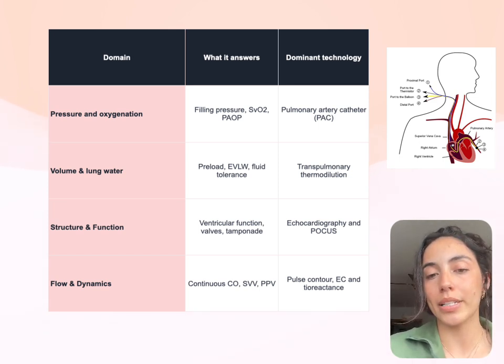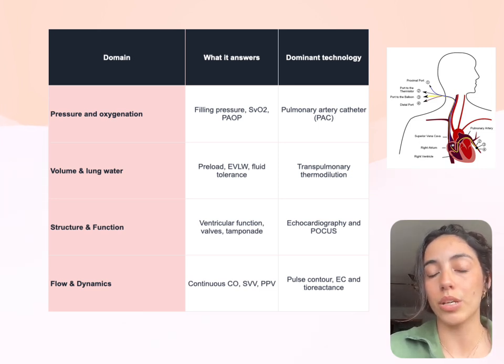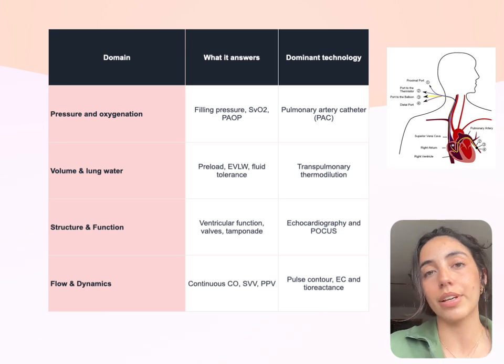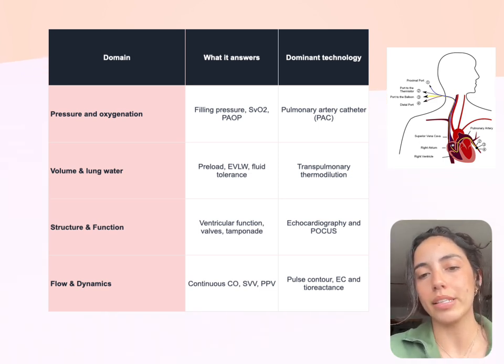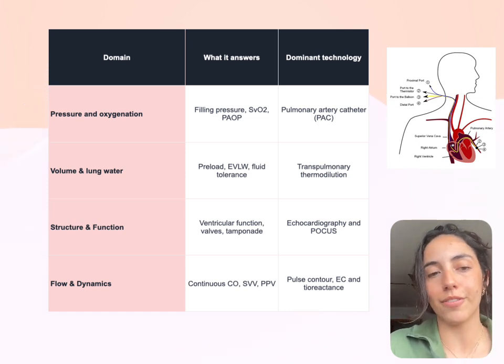In terms of the flow and dynamics, this is a more up-and-coming field, which is composed of pulse contour, which is minimally invasive as it requires only an arterial line, and the completely non-invasive electrocardiometry and bioreactance. I should also mention that obviously echocardiography and point-of-care ultrasound are completely non-invasive options and are very valuable in a clinical context.